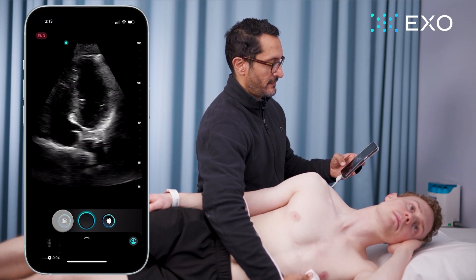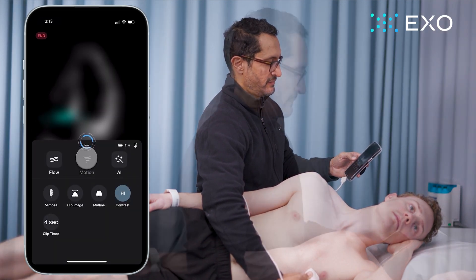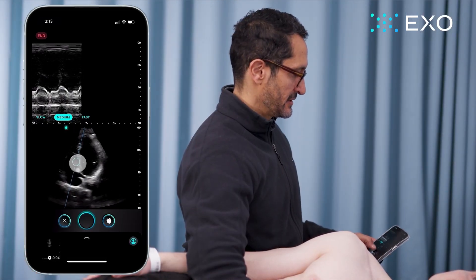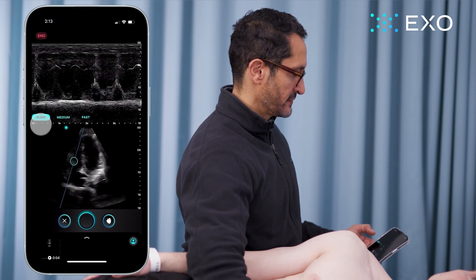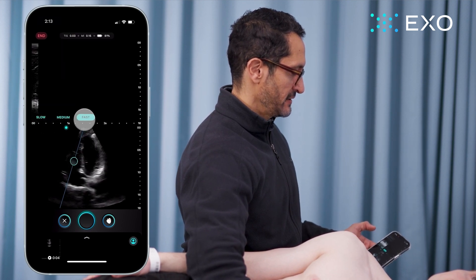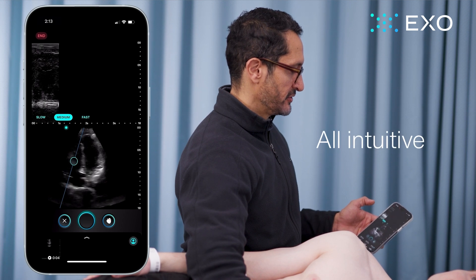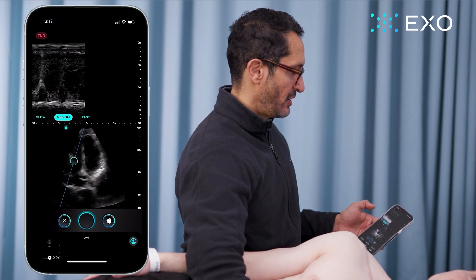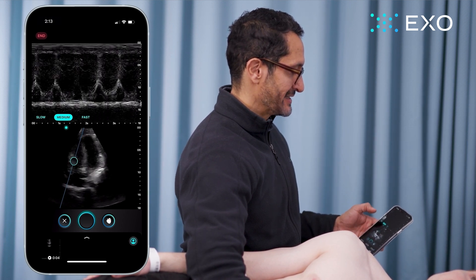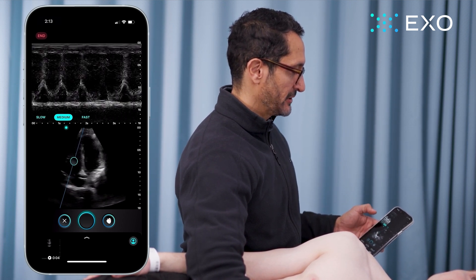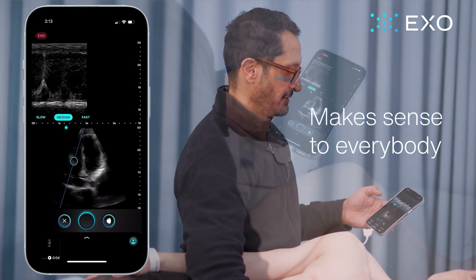From this view, if I want, I can use my M-mode. I'm going to hit motion, slide my gate, and I can change from slow to fast. Really easy to do. All intuitive. All built around the user — built around the clinician that's not comfortable with ultrasound, and in a way that makes sense to everybody.